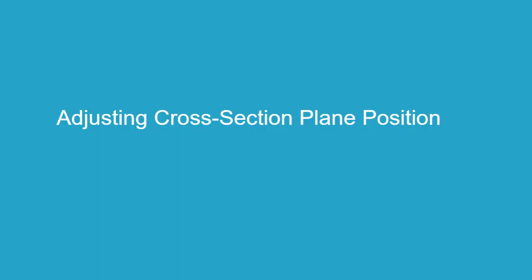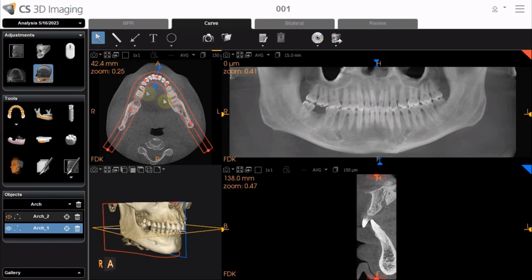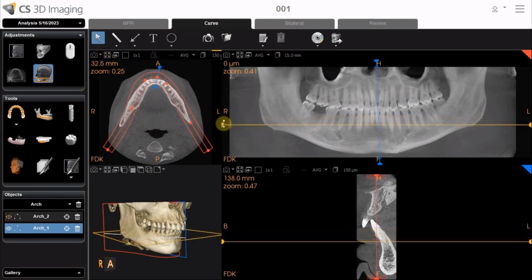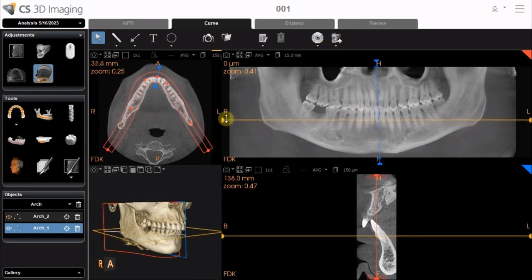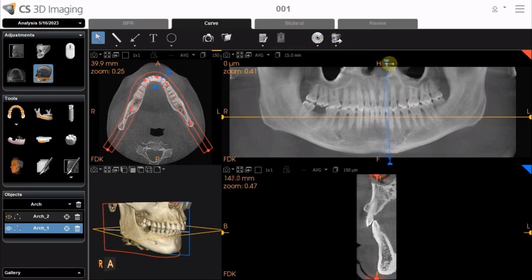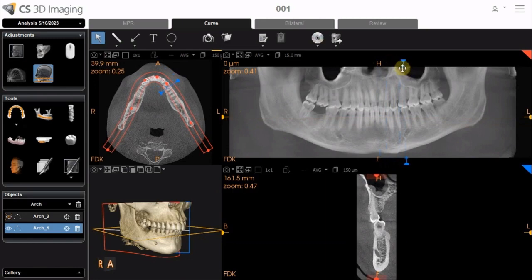Adjusting Cross-Section Plane Position. Click to activate Select Mode. Then, use the yellow and blue handles in the reconstructed panoramic view to adjust the position of the cross-section plane. The position of the axial slice cross-section plane is updated dynamically in all view screens.